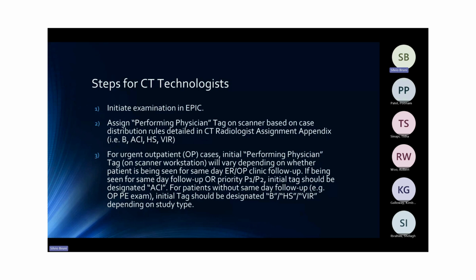The WFO, the workflow orchestrator, will then distribute those cases to the various B lists appropriately. For all other case types, VIR, high-res lung, head and spine, the tag for assigning these cases remains unchanged. So you set those exactly as you would now on the scanner using that performing physician tag.